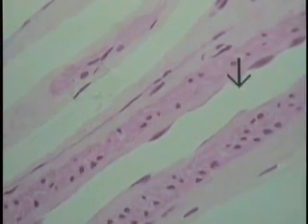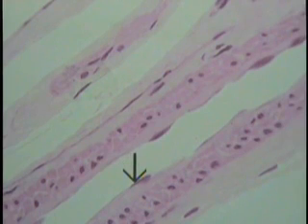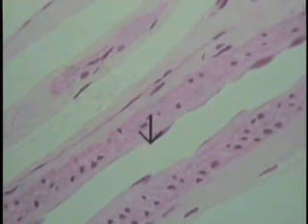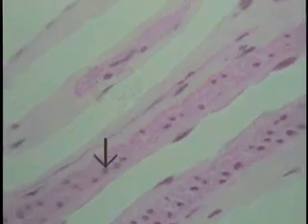Once again, you can see it's lined by the nuclei of endothelial cells, and in this particular case this little light gray line is the depth of the cytoplasm of these very flattened, plate-like cells that you can see lining the lumen interior.